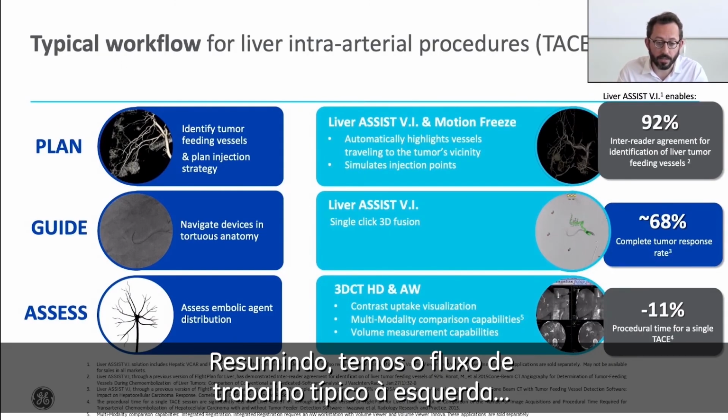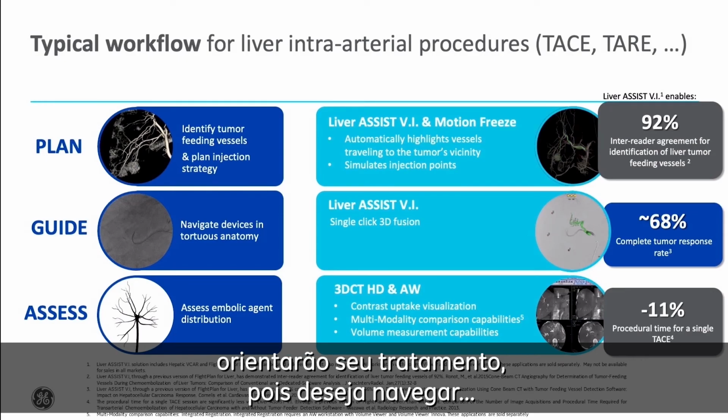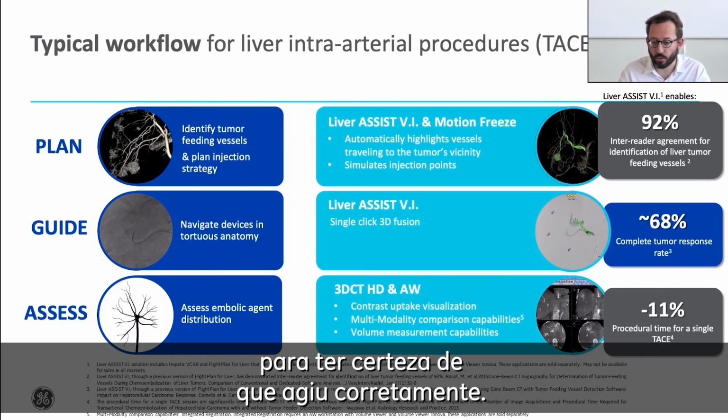So to summarize, you have the typical workflow on the left-hand side that you are very familiar with for chemo or radioembolization. You plan the treatment, you identify the tumors and the feeders, you guide your treatment because you want to navigate your device through this tortuous anatomy, and then at the end, you assess what you just did to make sure that you did it correctly.